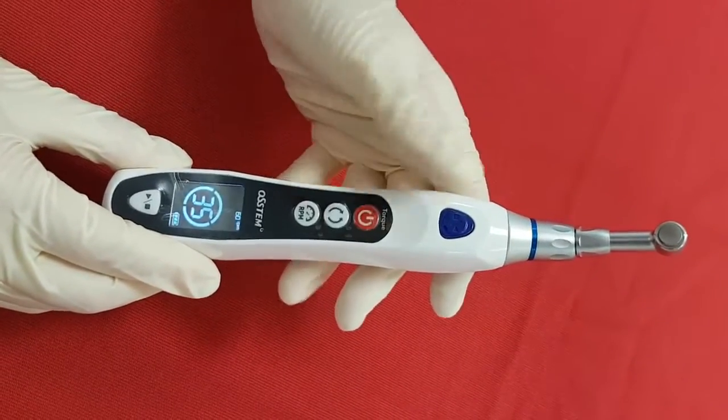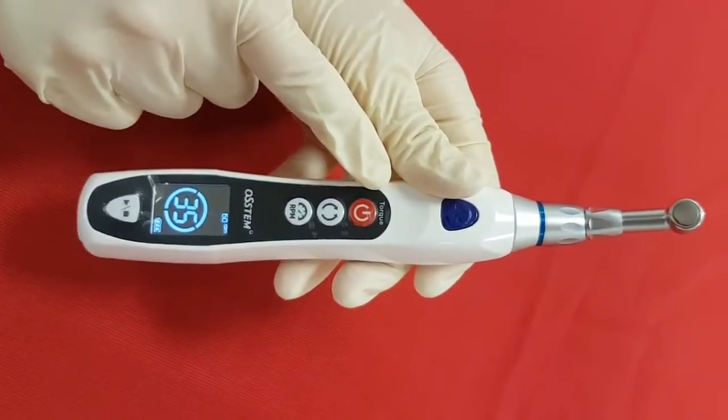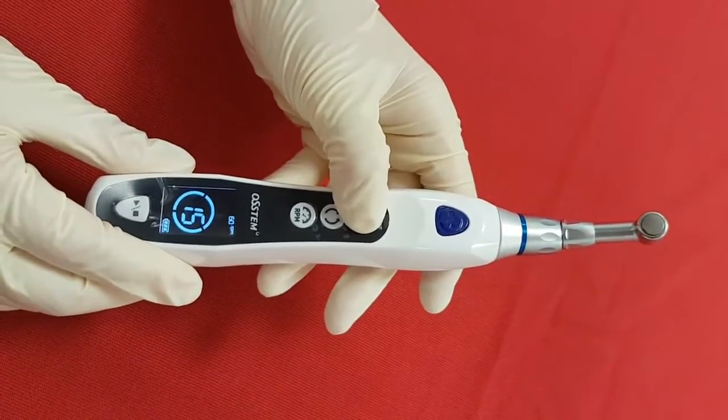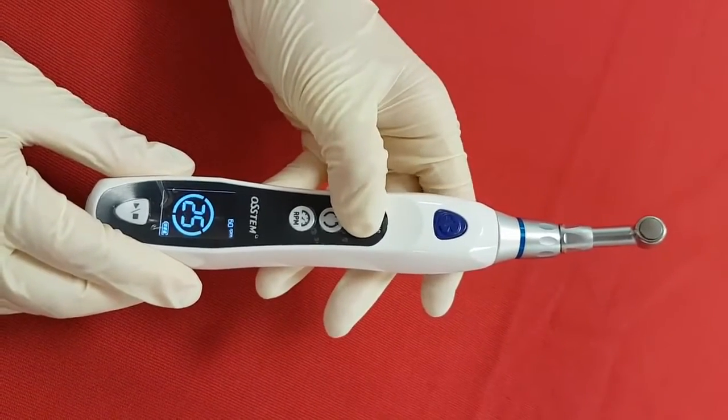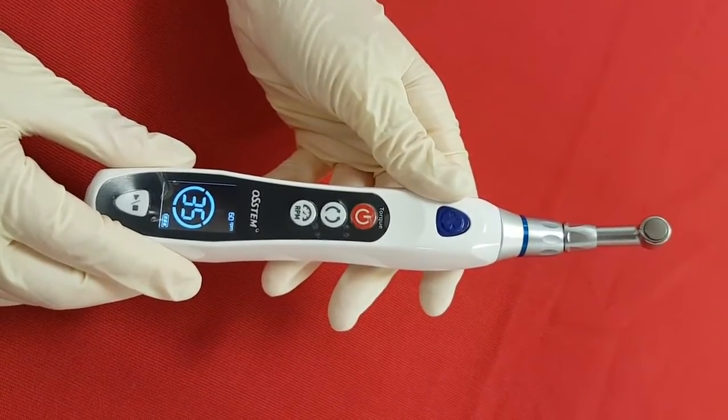This red button has another function, which is to control the torque value — you will see the torque mark here. The torque value increases by 5 Ncm when you press the button, and the applicable torque range is from 5 Ncm to 35 Ncm.